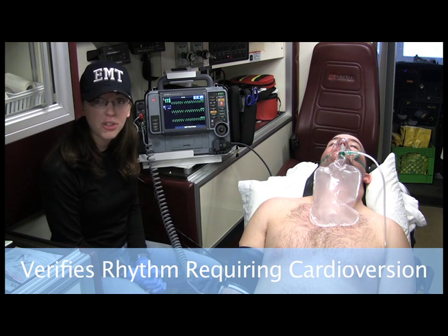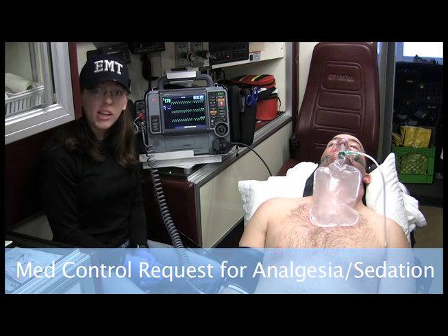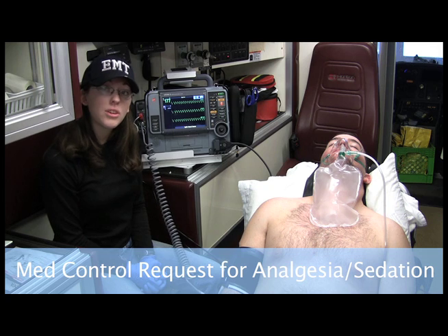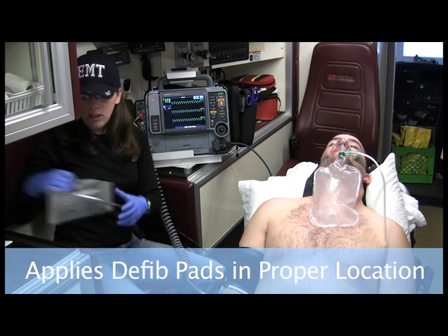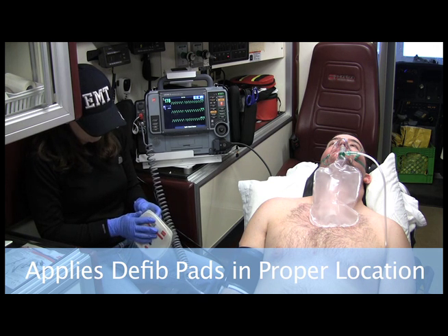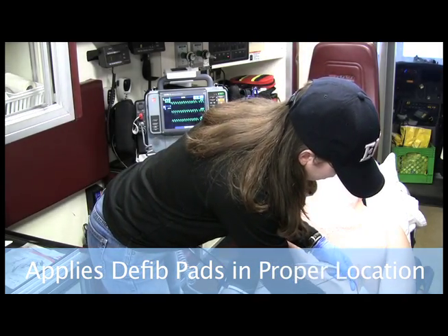So I am considering cardioversion. Now in my region, I have to contact medical control before I cardiovert. So while I'm talking to them, I want to get my appropriate joules to set it at, and I also want to ask for a sedative or an analgesic. So once I've been given the go-ahead, I take out my quick combo pads and I'm going to attach them, just like in defibrillation.